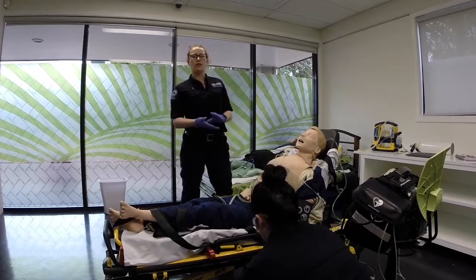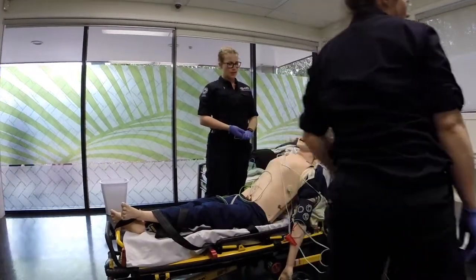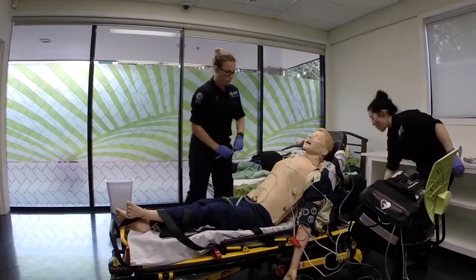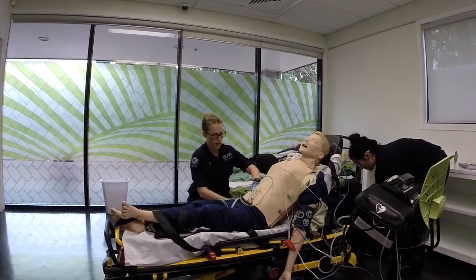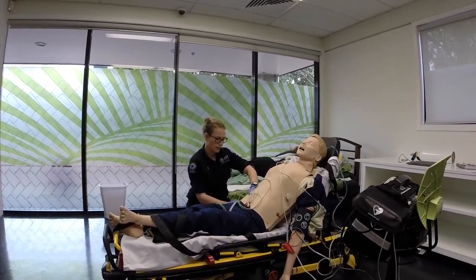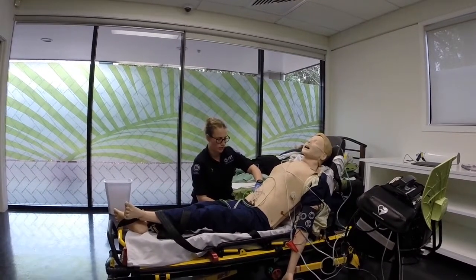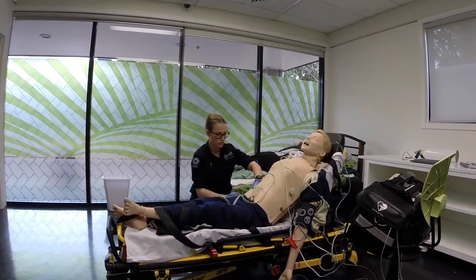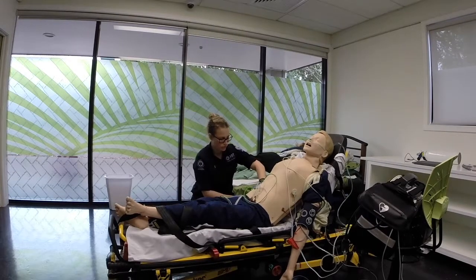Cool, thank you. So how is that pain going now, Bob? Oh, it's still really sore. Still really sore, so I'll give him some more fentanyl. And cool, so Gemma's just setting up for a resus potentially, just in worst case scenario. So I'm going to give him another 50 micrograms of fentanyl. And that flush.